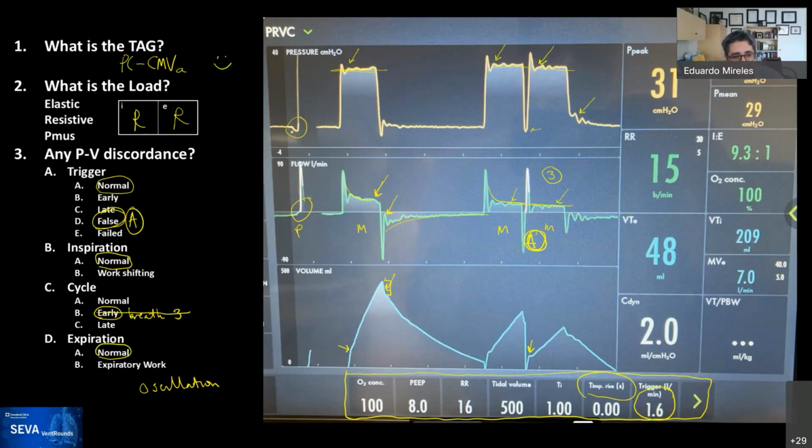So maybe he is able, but actually, the way that I think about this, and I would like to hear if anybody thinks otherwise, in a patient with obstructive lung disease, the respiratory rate is the maximum expiratory time that the patient will have. If the patient starts breathing above that, anything that the patient does above that is going to be shorter expiratory time.